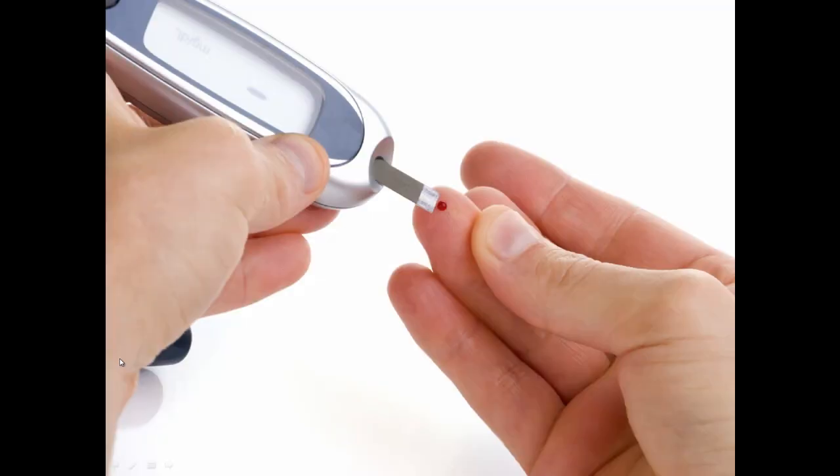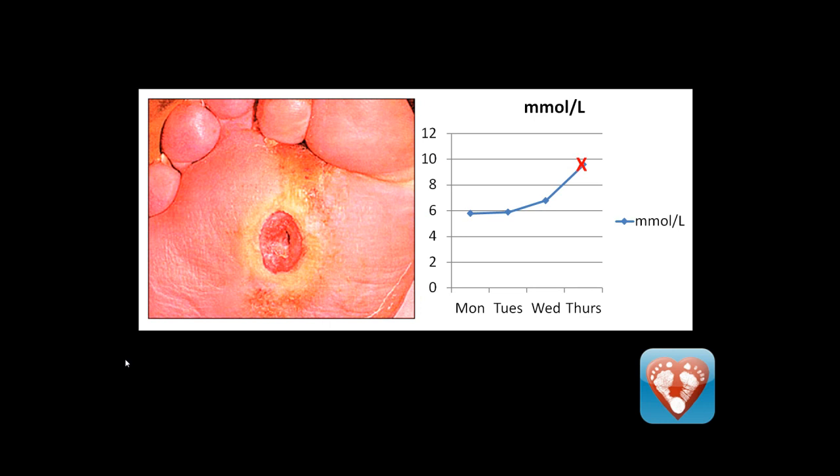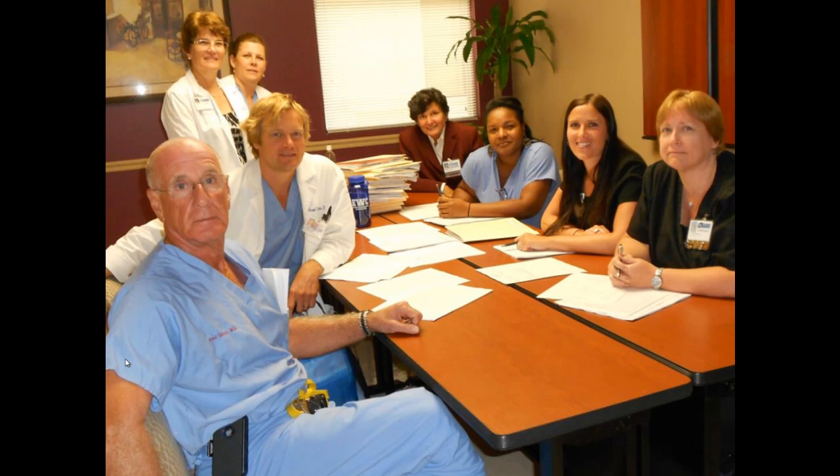As blood glucose can be challenging to control during infection, myFoot will also put the blood glucose reading for the time of the image together to give a further indication of whether an infection is present. This data will eventually write directly to the patient's EHR and will allow their multidisciplinary team to monitor the healing process and help with management.